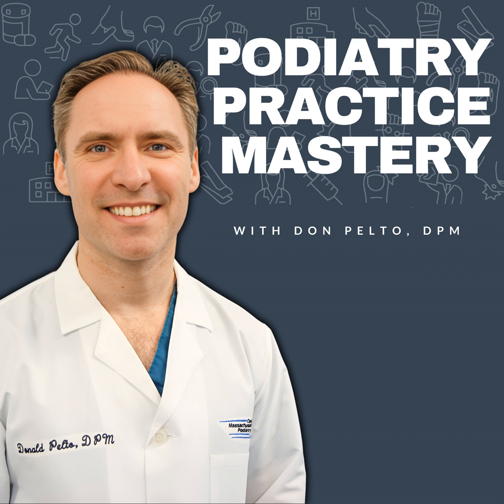And my process, so for example, a patient came in today that needed a biopsy, and one of my colleagues sent them over. But even if they didn't, the process is, if I see someone needs a biopsy, I have a little button in my room, so I click the button or I open the door, and that triggers my staff. They come in, I say I'm going to do a biopsy, and what that triggers for my staff is that I need 1 cc of Lido with epi, and I need a consent for a biopsy, and that's about it. They do the lidocaine first, and then they do the consent second.